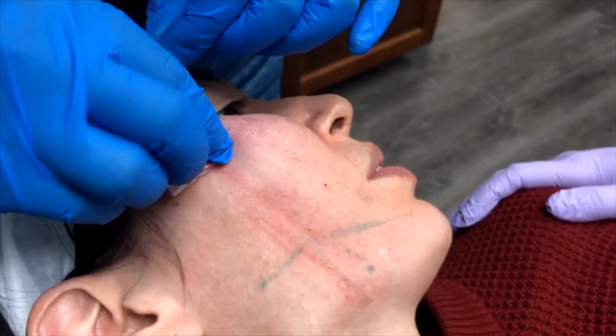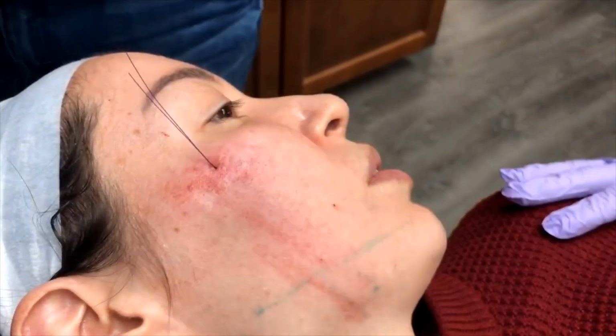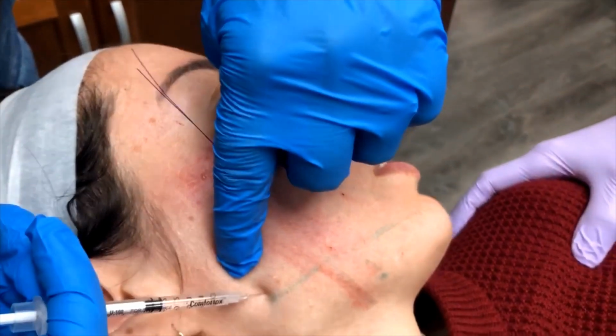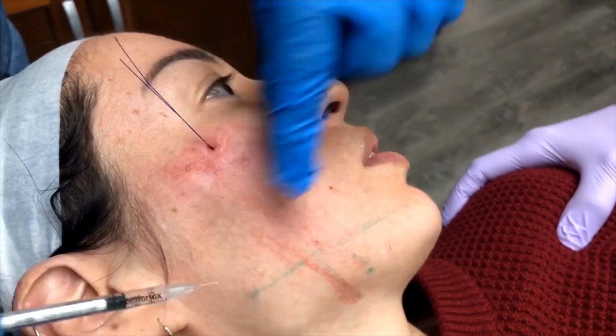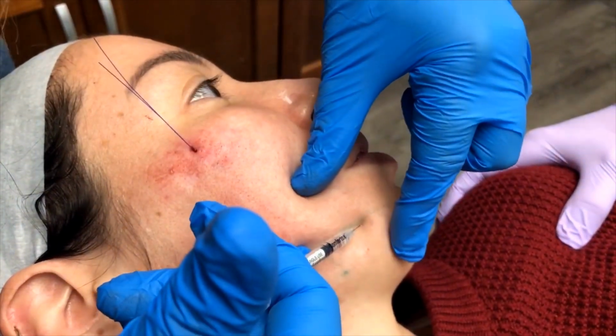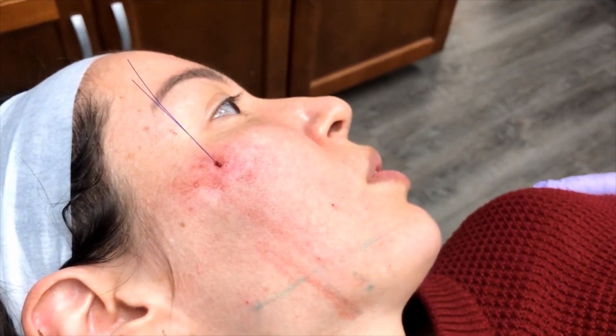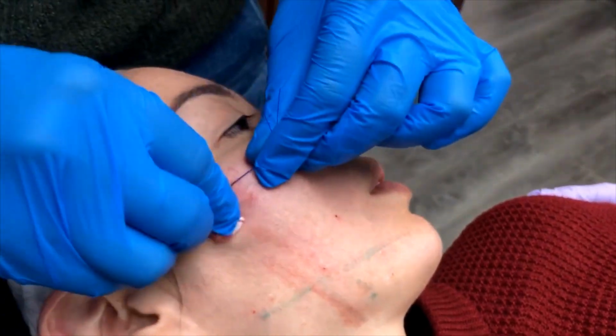Look how beautiful that is. That didn't take very long to accomplish there. And again, the strength of the V-Soft Lift threads is unparalleled. Put it up against any other company that's out there, and you'll see them using 3 to 4 times the number of threads for this exact same case.